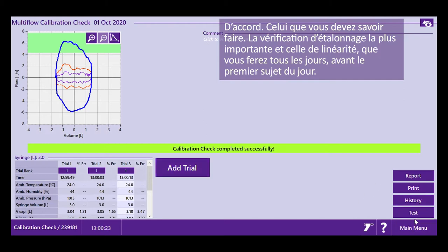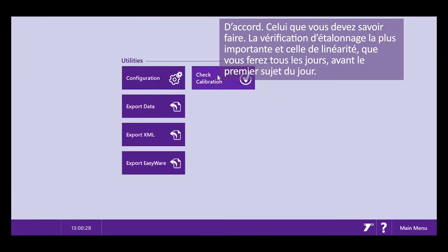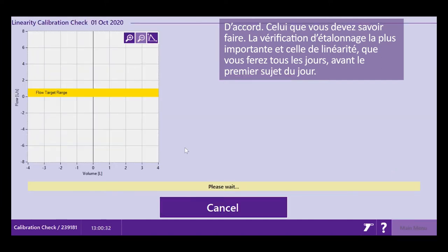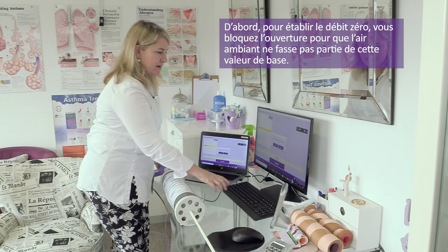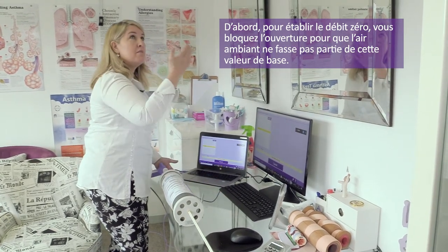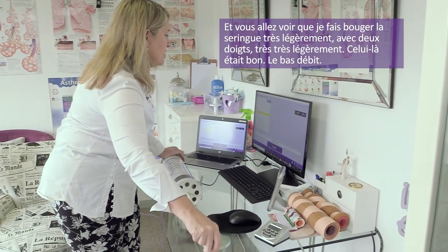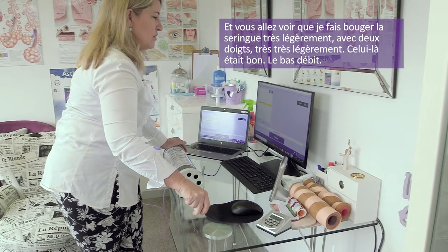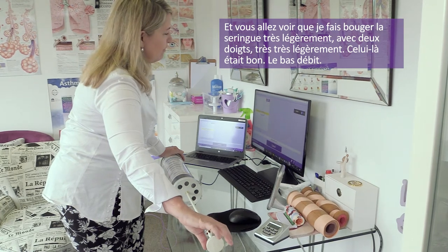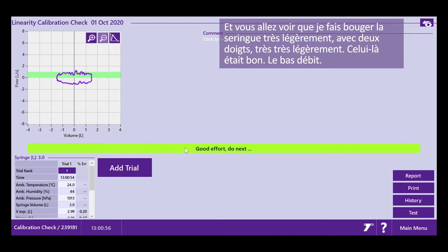The most important calibration check is your linearity check — this is the one that you will do daily, before your first patient of the day. First, occlude the outlet to set the baseline flow so it doesn't measure any airflow through the air. Now I'm going to pump my syringe at different flow rates, moving it very, very softly using just two fingers at low flow.